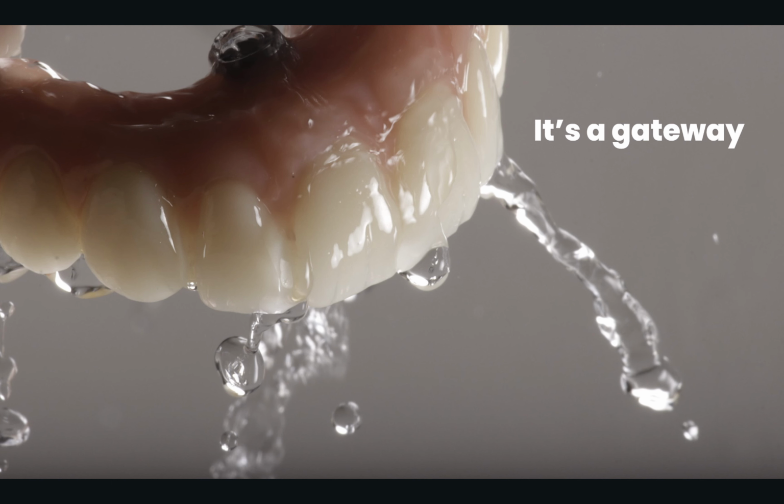And the benefit is the orientations of the tooth files that you're placing in SmileCloud translate directly across to something like ExoCAD. I keep using ExoCAD as the example because that's my main one that I'll jump out into. And so 90% of the design is done. It's just finessing what you need to do with some of the smaller details in ExoCAD.